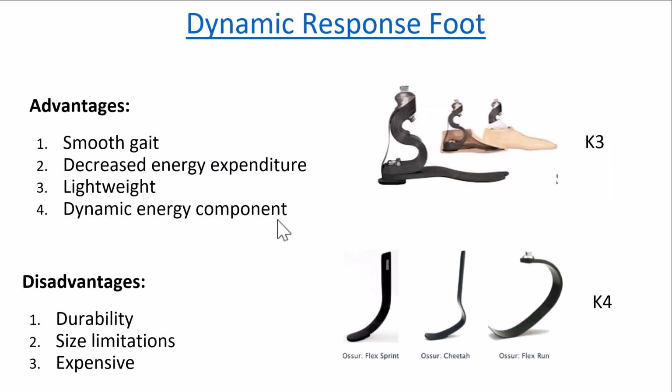The dynamic response feet, so the K3 version is shown at the top right hand side of the slide. The K4 version shown at the bottom. Remember, K4 are those individuals who are very physically active, or young adults who are very physically active.